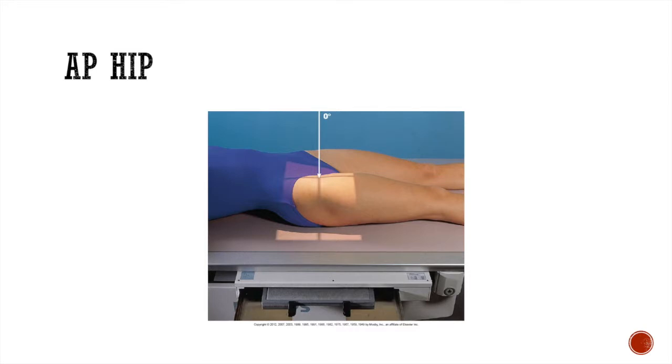and you can use an AEC center cell with a kVp of approximately 70 to 75. You want to take the exposure on suspended respiration and, of course, mark the right side of the hip, or the correct side of the hip, which may be the right side.